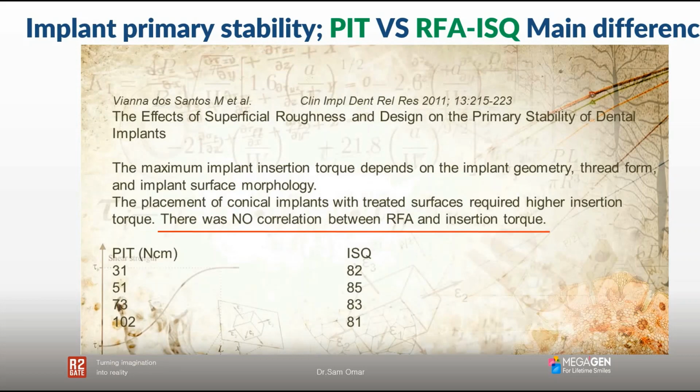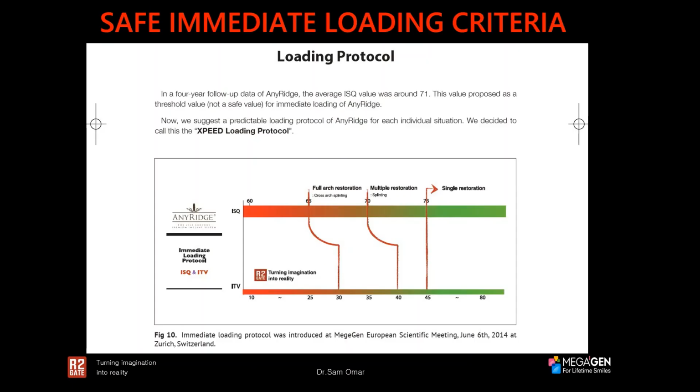These are the two most cited and most documented methods to assess implant stability in the literature. Would you use insertion torque, or would you use ISQ, or will you use both? And the answer is actually both.